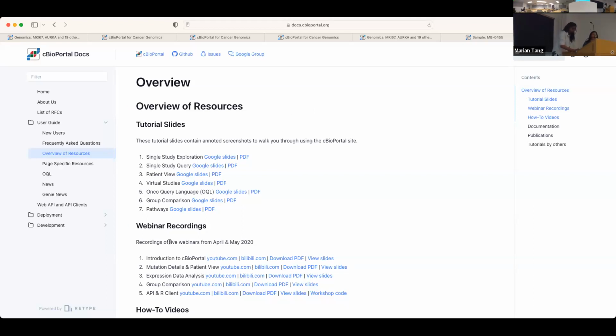So they have a great resource here. There's a question. Since no one has a question. Go ahead. Unless someone else has one. Yeah, there is one question, but it's okay, go ahead first.